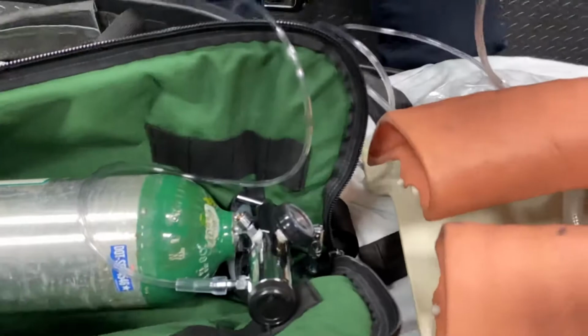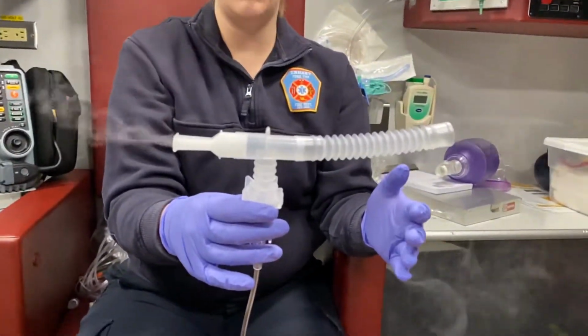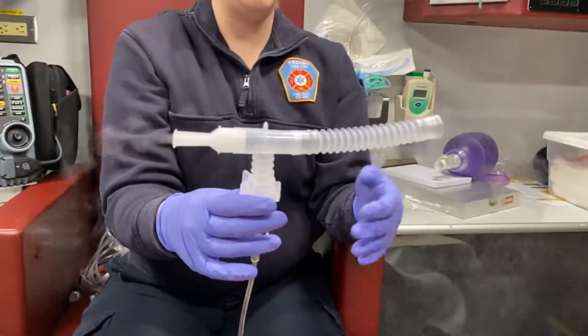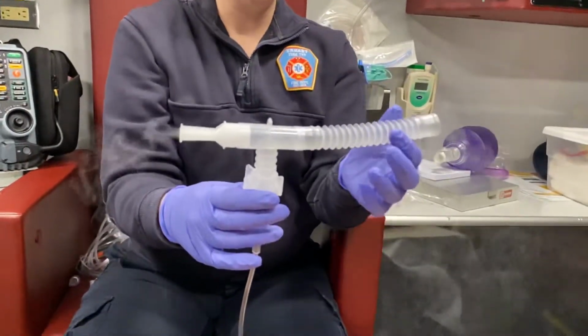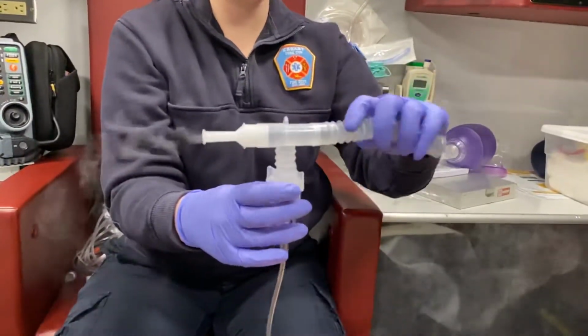So I base it on what my patient's symptoms are. If they're pretty mild, I'll go ahead and just put it on 6 because it will last longer. If they're having a lot of difficulty breathing and maybe need that medication a little faster, I'll up it to 8 liters per minute. This does bend, so you can bend it away from the patient or yourself.